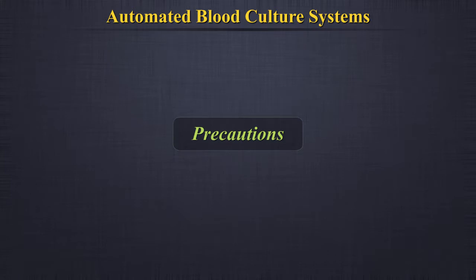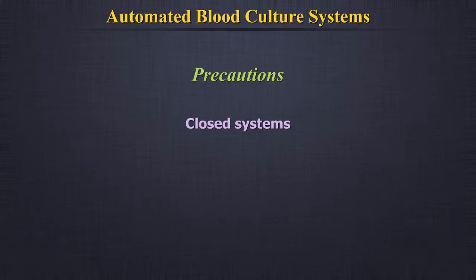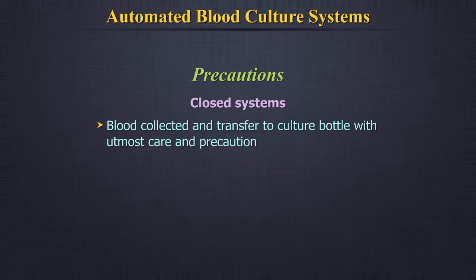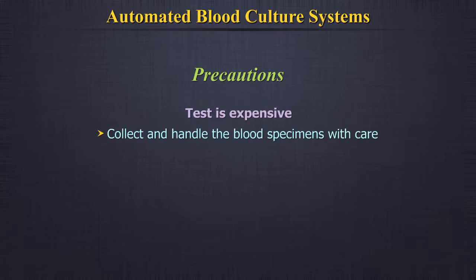Precautions. Continuous monitoring automated blood culture systems are closed systems — that is, they minimize contamination by minimal handling of the blood. Therefore, it is important that the blood is collected and transferred to the culture bottle with utmost care and precautions. Also, the test is expensive when compared to manual methods, so it is in the best interest of the patient as well as the laboratory to collect and handle the blood specimens with care.